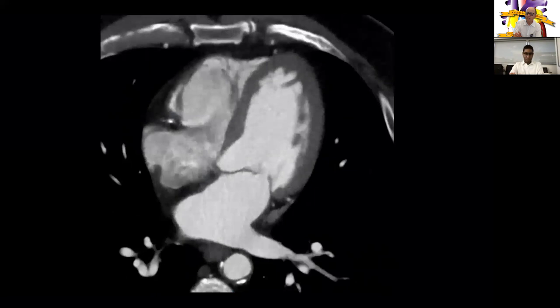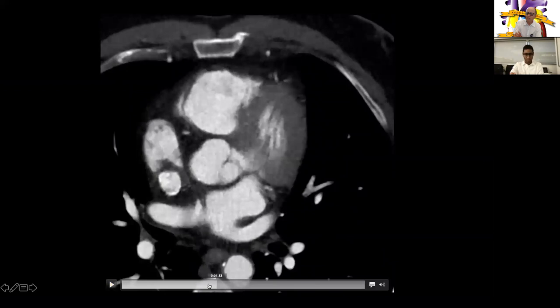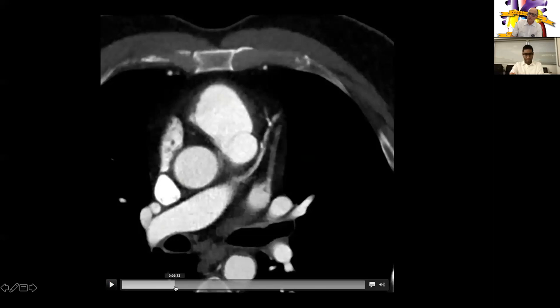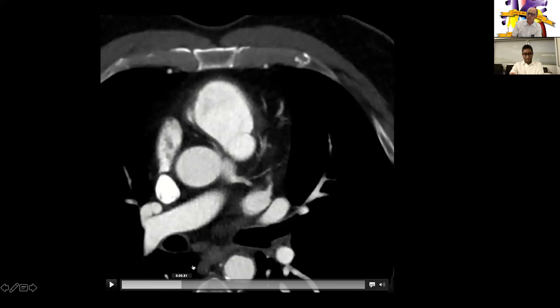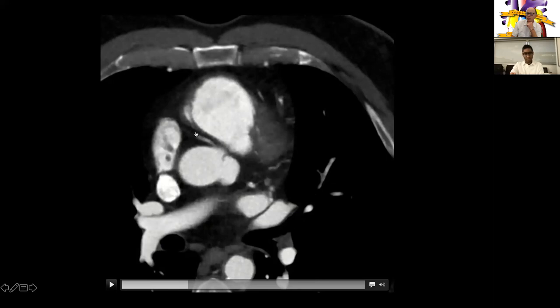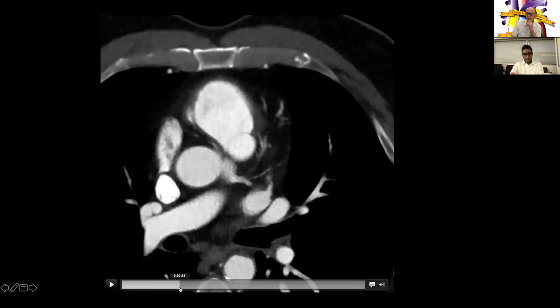He gets a CTA done. Going over the images, you have the aorta here, the pulmonary artery here. The left coronary comes out in its regular position, but we see the right coronary artery coming out from the left sinus. It then traverses between the pulmonary artery and the aorta — an interarterial course — with a slit-like origin and acute angle, suggesting a concerning course of the anomalous right coronary artery.